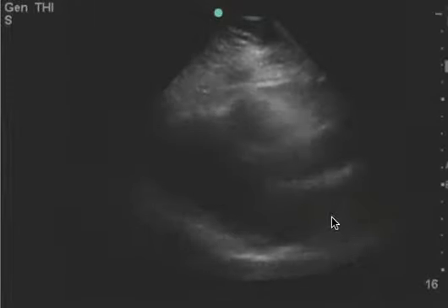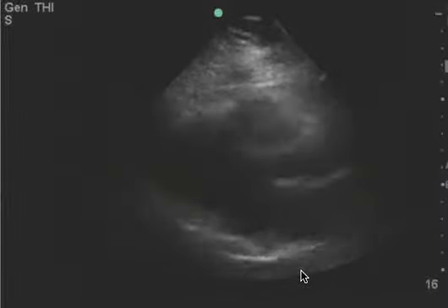This is a cardiac ultrasound — left ventricle, left atrium, this is the aorta, outflow tract. You can see the descending aorta here.